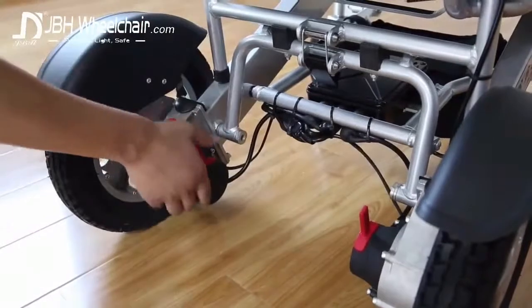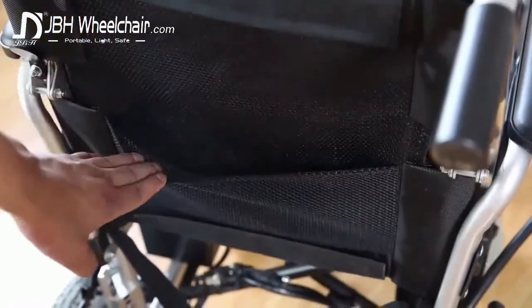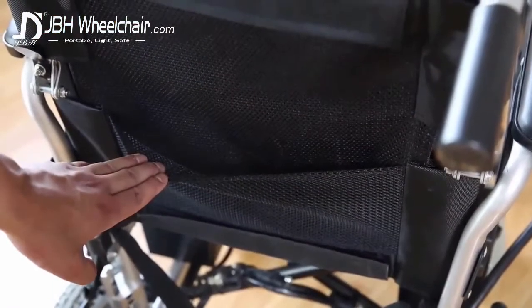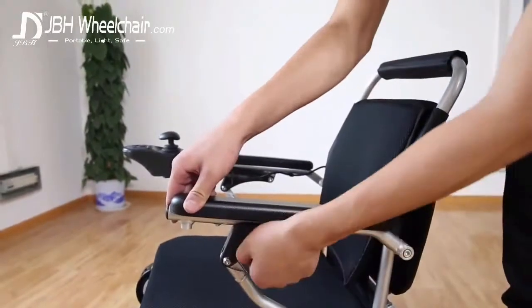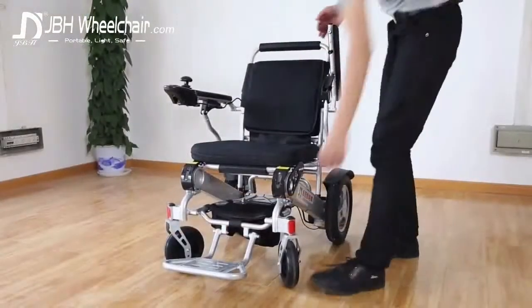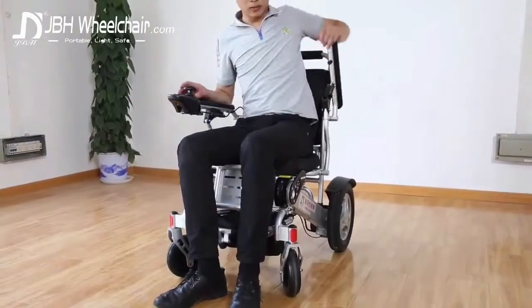Switch the chair into power or manual mode. When in manual mode, the added pocket will come in handy. The cushioned armrests can be easily flipped up along with the footrests for those of us who find many wheelchairs difficult to access.